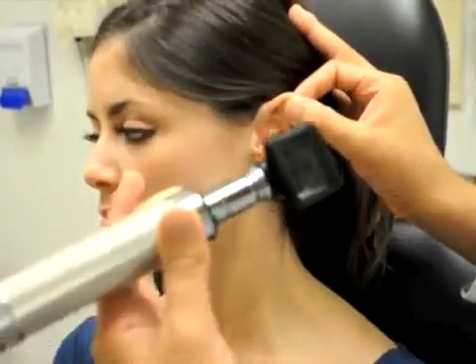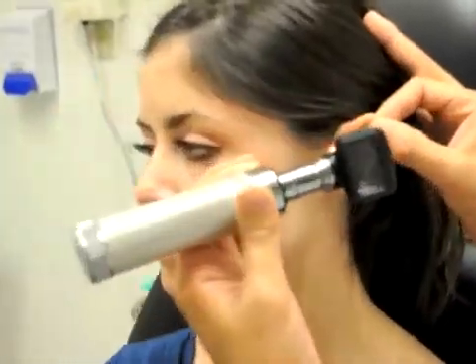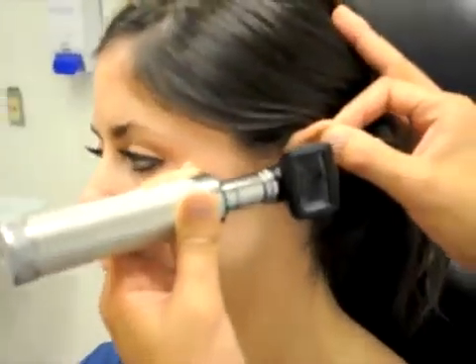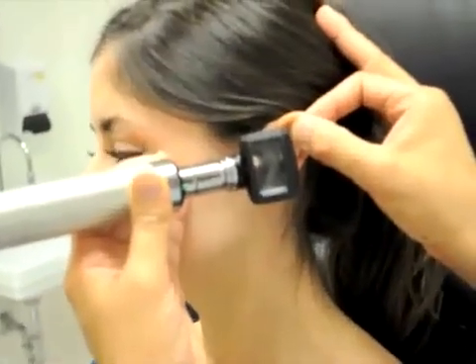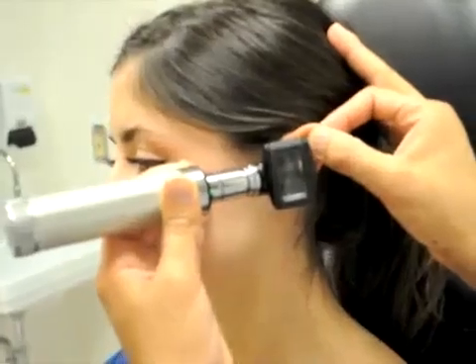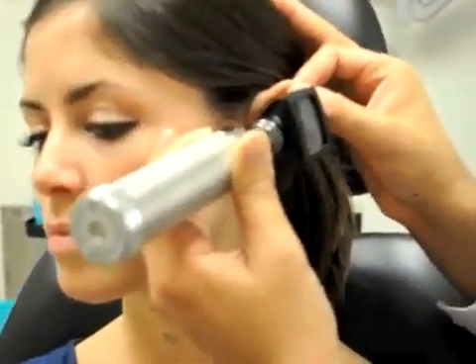The next thing I do is I take my otoscope and I rest my hand on Brittany's cheek here and insert the otoscope into her ear, taking care not to go too deeply, as this will cause her pain if the otoscope actually contacts her bony external auditory canal. Then I can look through the otoscope and examine the necessary structures of her ear.